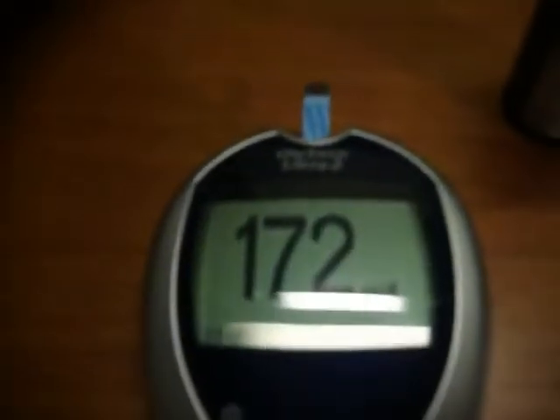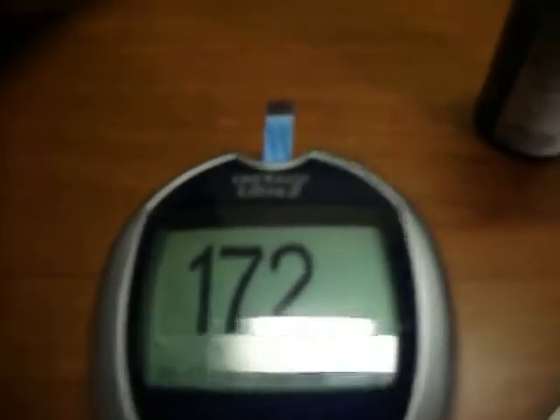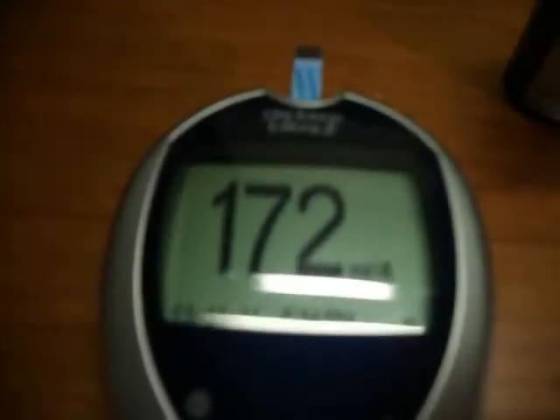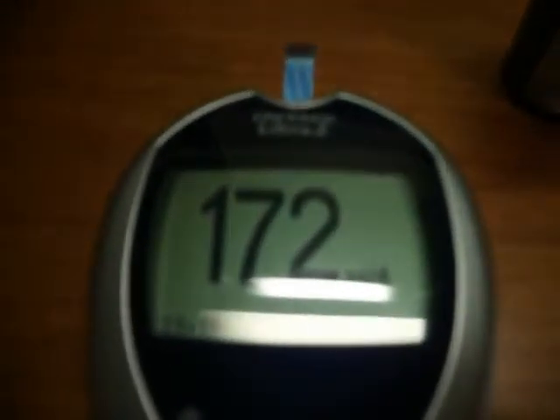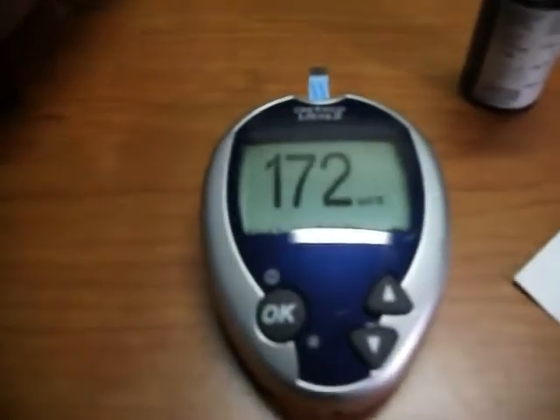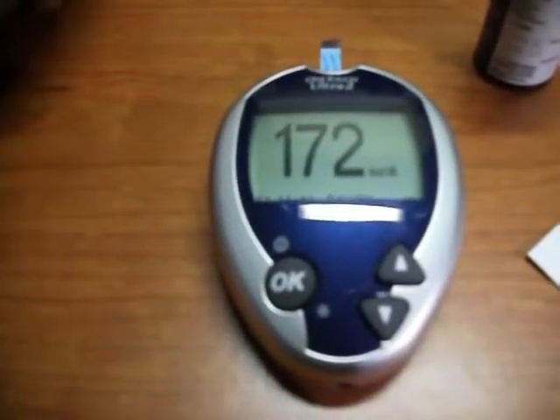My reading is 172 and given that I ate lunch only about two hours ago, that is consistent with a diabetic reading. This is how to test your glucose levels at home. Tanya Malinovsky, out.